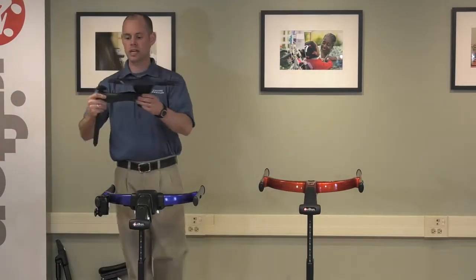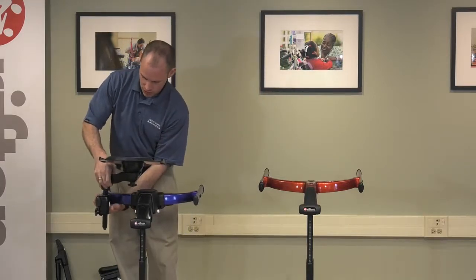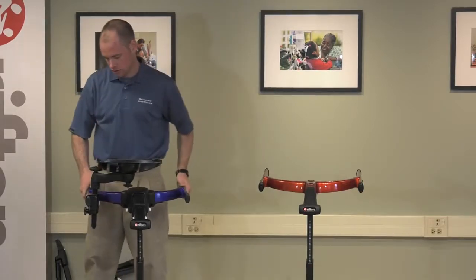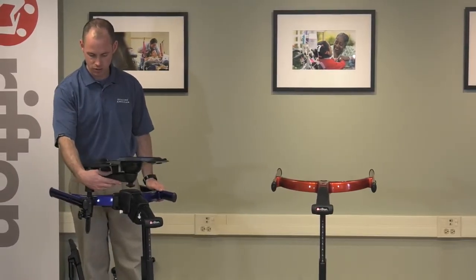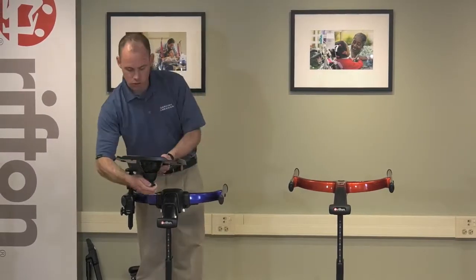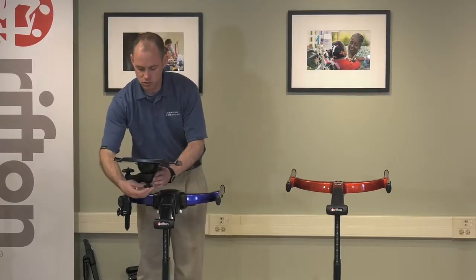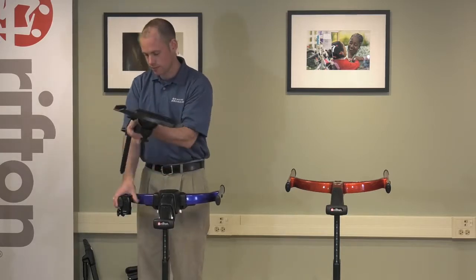And as you can see, this communication tray has an arm that can swing around to allow you to have the communication tray directly in front of the client. It has a knob up on the top for you to be able to swing the communication tray around to get it where you want. And then, like before, you can always loosen the knob underneath to adjust the tilt of the communication tray or to turn it from side to side as you need. So that's the new communications tray.